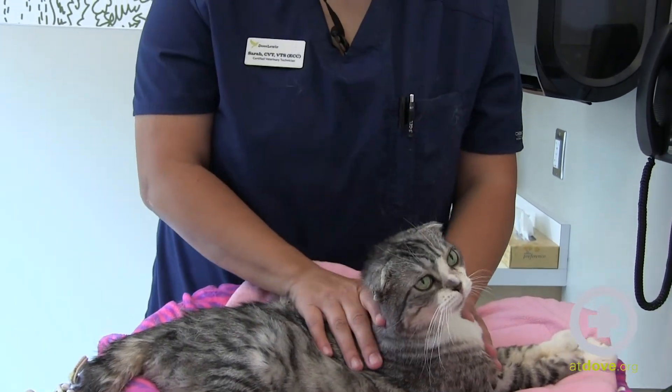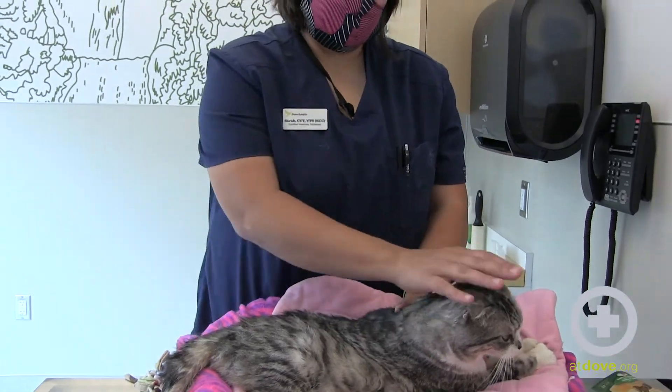It feels like a teeny tiny bee sting, but the needle is really small so they tend to not react too much.